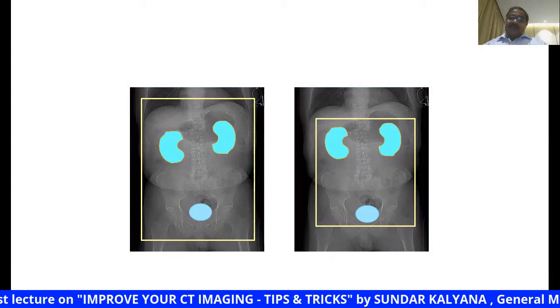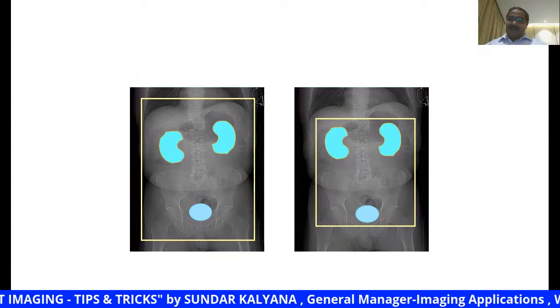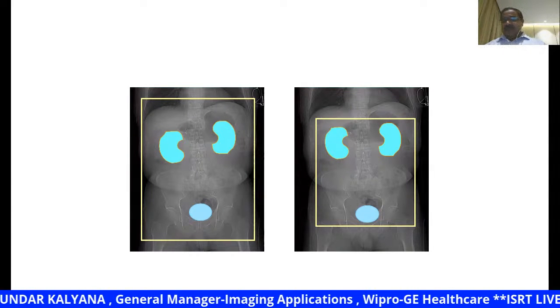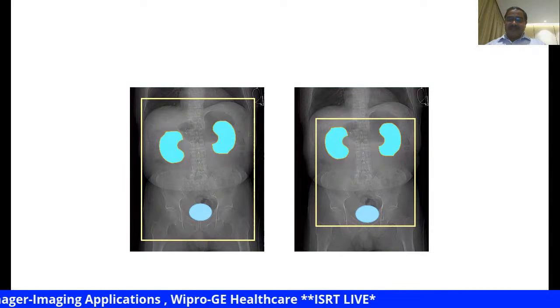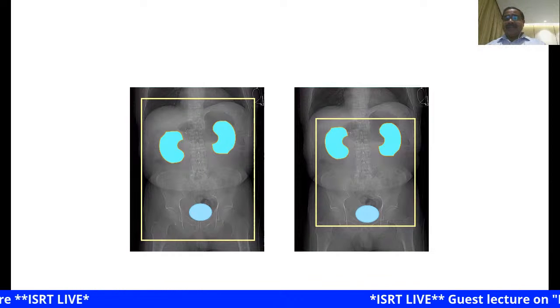Another very interesting fact is to scan only what is required. Many times we do overscan. Is it required? We don't know. As technologists, many times radiologists may not be present during the scan, and we simply follow the protocol straight away rather than the clinical need.